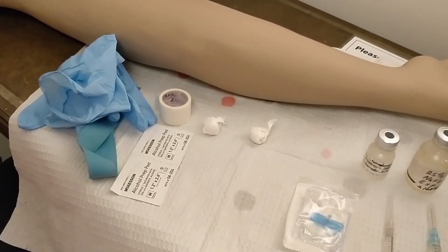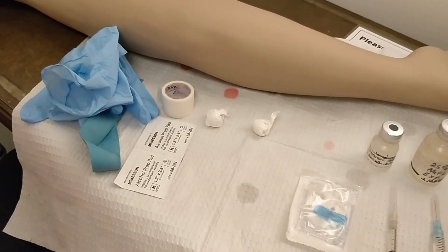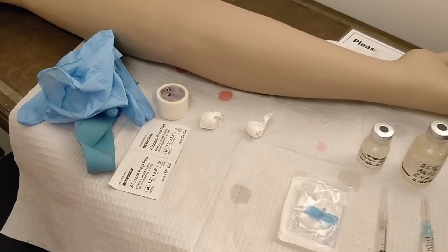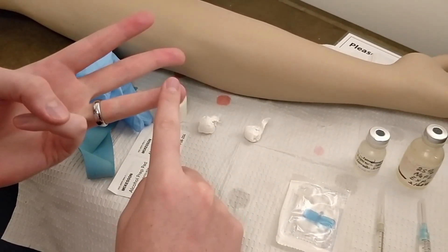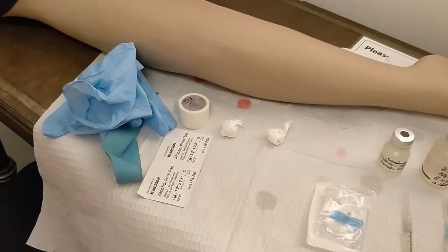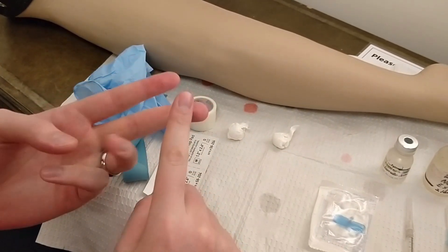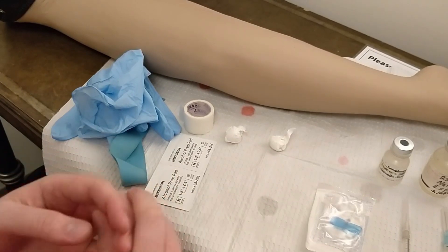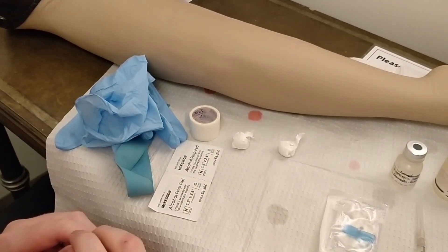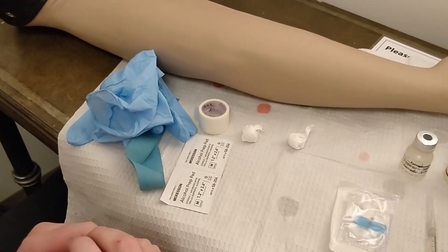First thing we're going to do is instruct the patient as to what we are going to be doing: 'Mr. Lee, we are about to inject some dye into your arm to take a look at the blood flow in the back of your eye.' Next, ask about any allergies: 'Mr. Lee, are you allergic to any medications, dyes, tape, or latex?' — those are the four things to ask about. Now discuss side effects: yellowing of the skin, yellowing of the whites of the eyes, yellow urine, and nausea. If you feel unwell at any point please let us know. One major side effect is anaphylaxis — although rare, we are prepared in case this occurs. Now we'd like you to relax and we will get started.